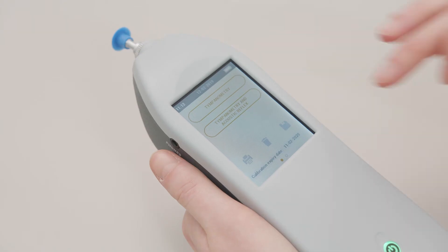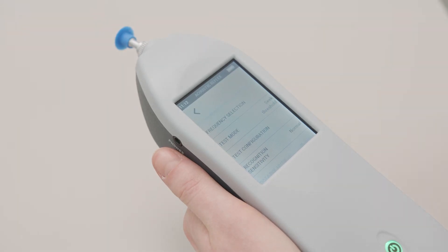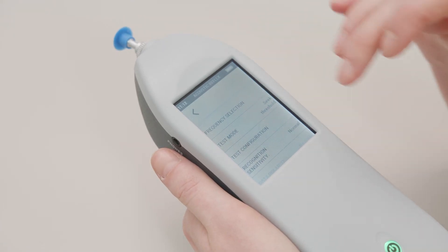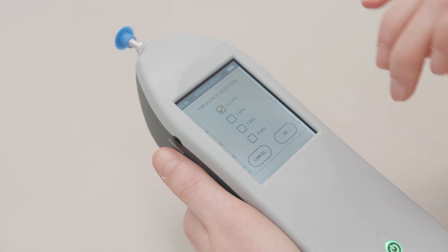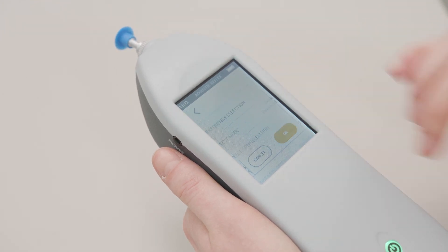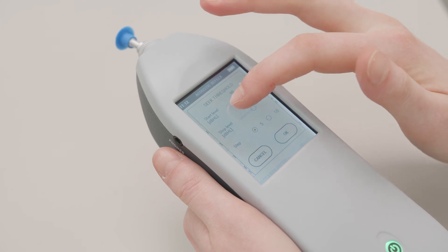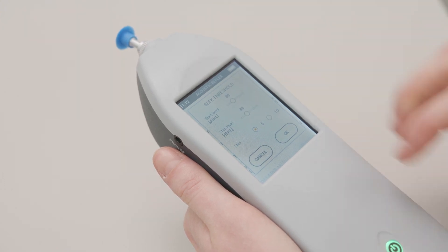From the home page you can also access the setup and the patient manager menus by swiping right. In the setup menu you can set the test mode for the reflex exam, choosing between fixed intensity and seek threshold. You can also select the frequencies to be tested in the reflex exam, and set the start and stop levels for the reflex test in threshold mode as well as the intensity step size.